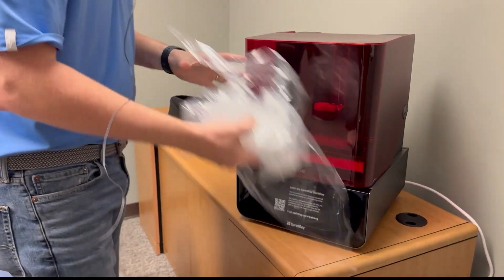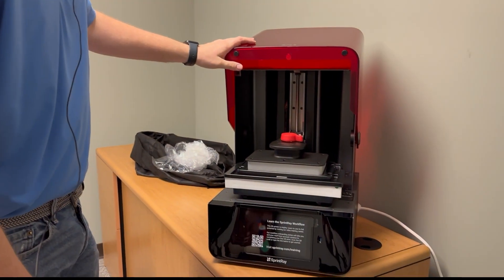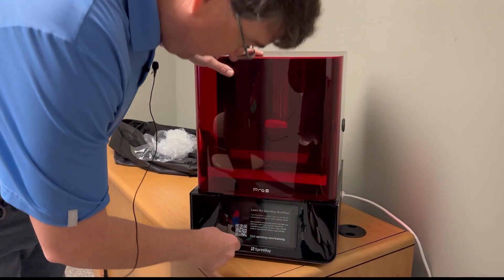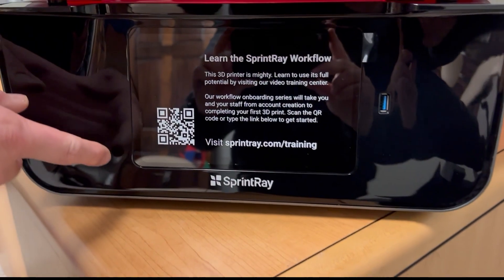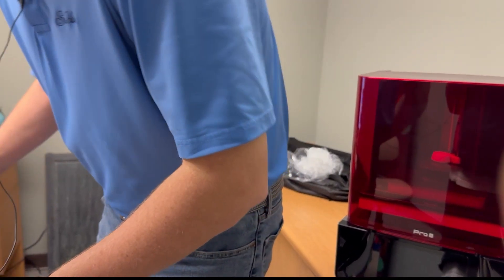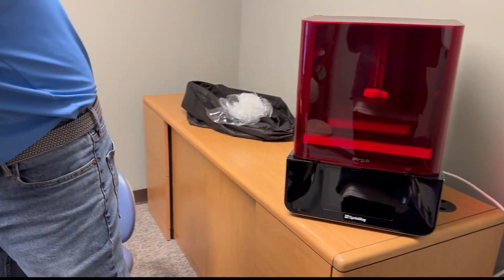Open it up. I know from using these things a long time, we'll have to actually turn it on to get the build plate up so we can detach the tray and everything. We've also got another sticker: 'Learn the Sprint Ray Workflow' — gives you a QR code to scan for sprintraytraining.com. I'm actually going to save that sticker. So let's find some power — we probably need to go back to the accessory box to get our power cord.